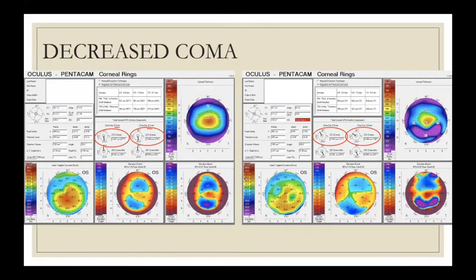I have a very good friend, again, Jack Parker, who's been doing lots of CAIRS in US, and he's also been doing these advanced cases and shared his results, where we have actually been able to do away with DALK in a large number of cases and been able to do just CAIRS, which is really a big advantage for these young patients. The coma really decreases a lot.